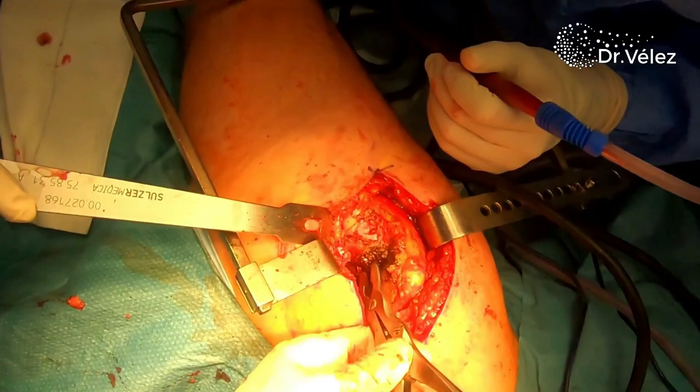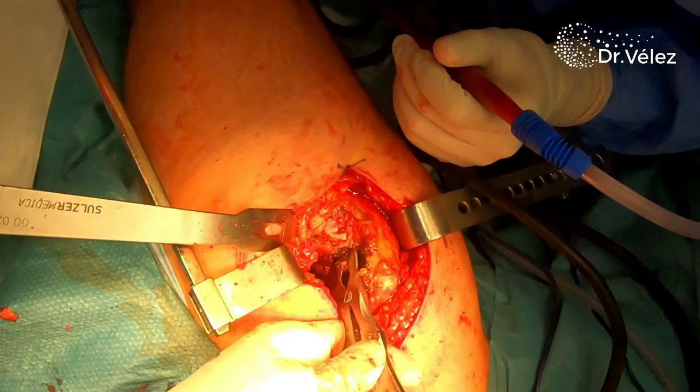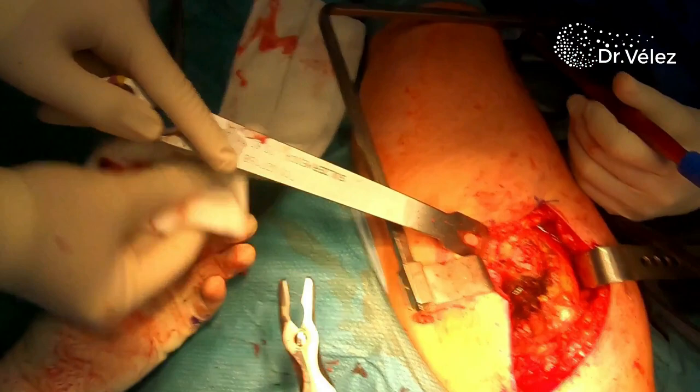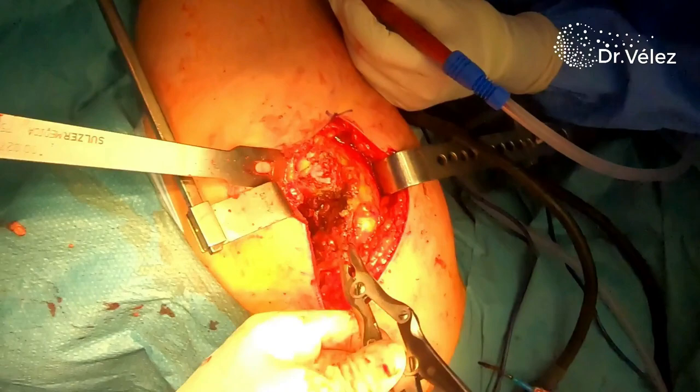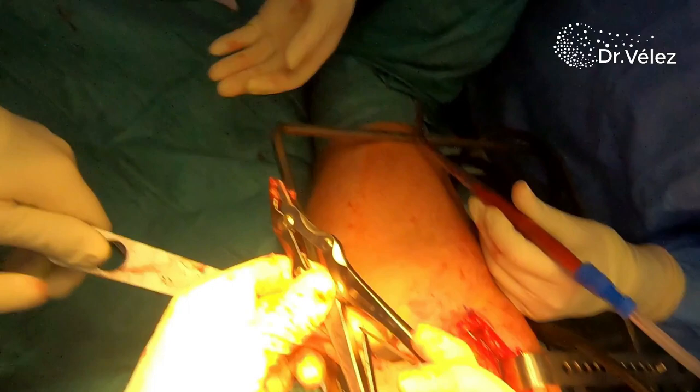So as you can see, the femoral head in the 48 millimeter diameter was loose, and when we tried to pass it in the 46 millimeter diameter measurement, it didn't go through. At this moment also, we send the head and the femoral neck osteotomized to analyze for pathology.